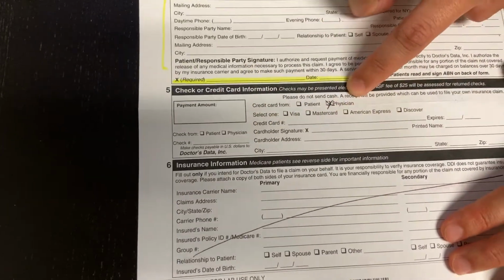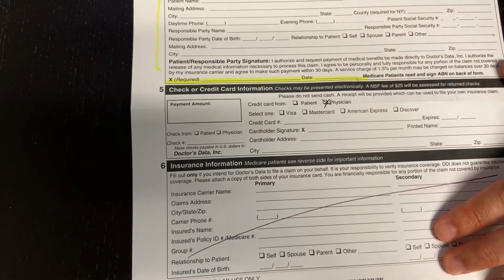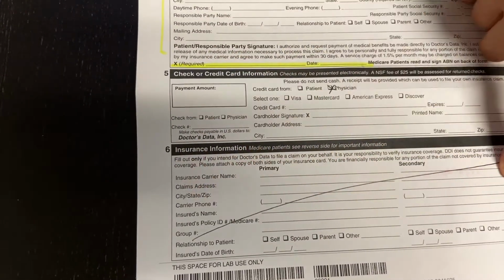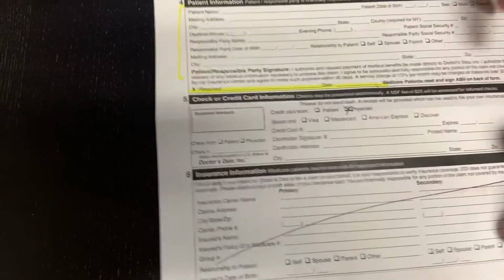Box number 5 indicates who is paying for the test kit. They will charge us because, like I said, you will have paid for the test kit at the time of service, so the physician box will be marked. And like we mentioned, there's no insurance that we submit for payment here.